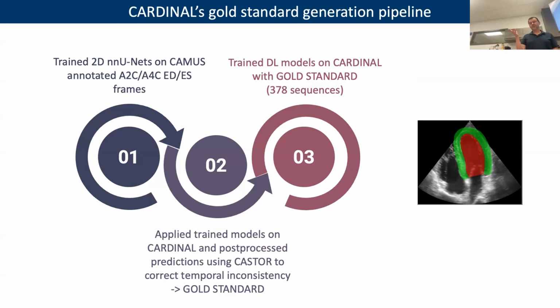So to give you the result directly without telling you all the different steps that we have done, we have shown that a simple 3D nnU-Net learning from the volume, so the 2D plus T, so seen as a volume, performs very well, and this is what I will show you.